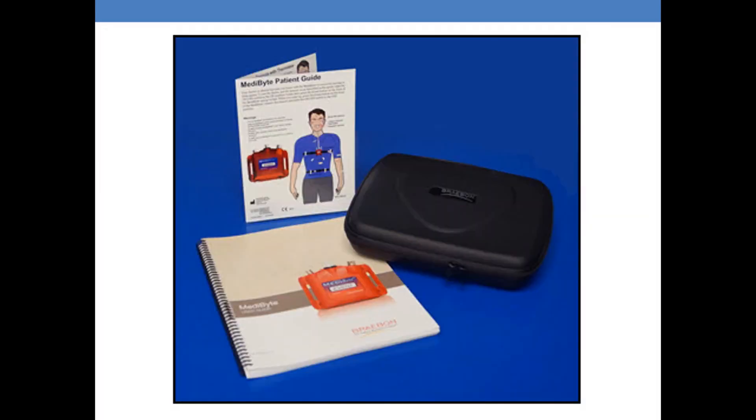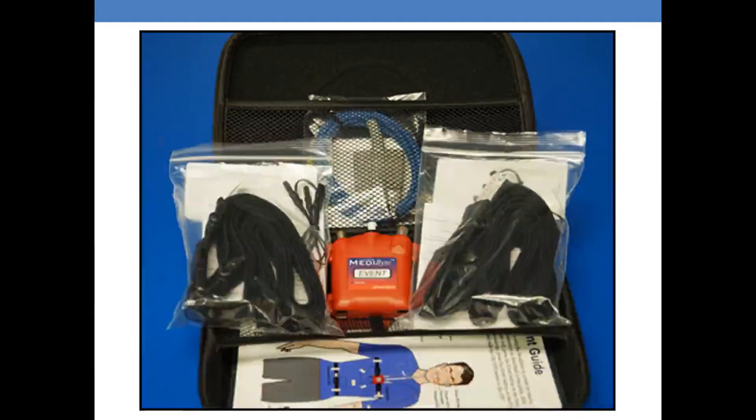The first items that you are seeing are the laminated card for the patient instructions, the carrying case, and the Metabyte user guide. Here's the Metabyte Light and its components — as we progress in this video we will look at these individually in more detail.